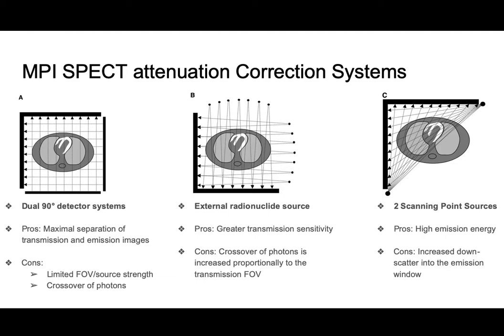I guess the point you were making was that your attenuation depends on the energy. Yes. So if you shoot, let's say, X-ray energies that are low dose, and you get a certain attenuation map, and then you now shoot a bunch of really high energy gamma rays, the map that you have is at a particular energy, not necessarily the one you're shooting at. And so there may be errors associated with the fact that you're not shooting and emitting at the same energy. From a purely attenuation map standpoint, you would want to have the same energy photons in those maps. Right? You would make an attenuation map from the same gamma rays that are being emitted, but you would shoot them in a different way. But that, I think, like you're saying, is a technological challenge to do.